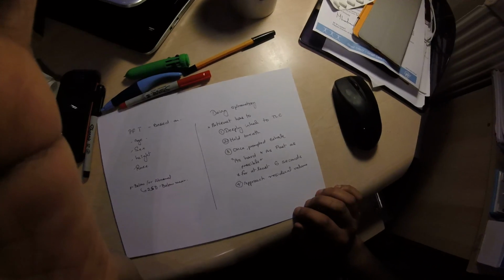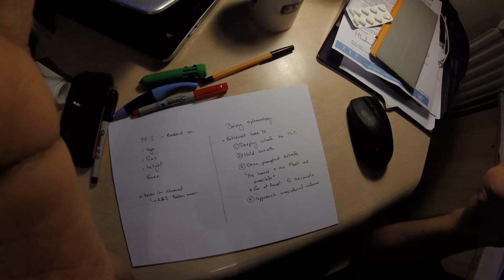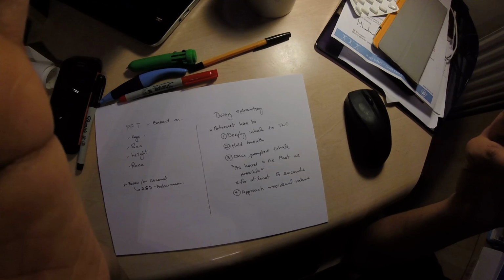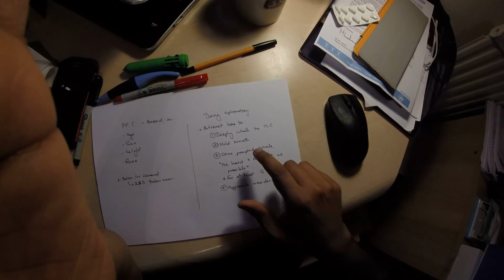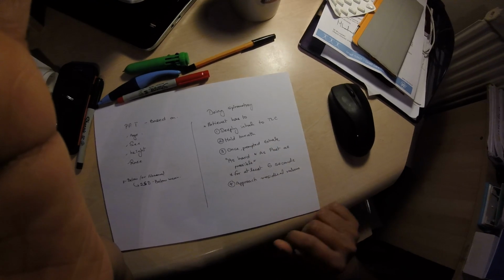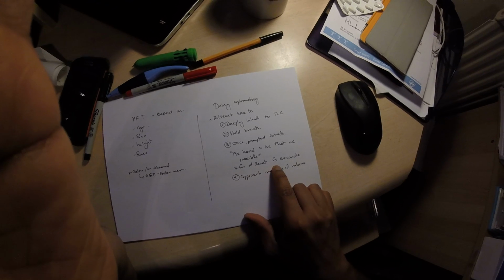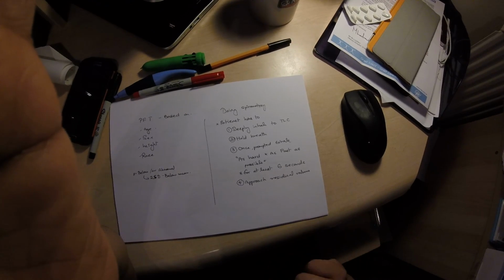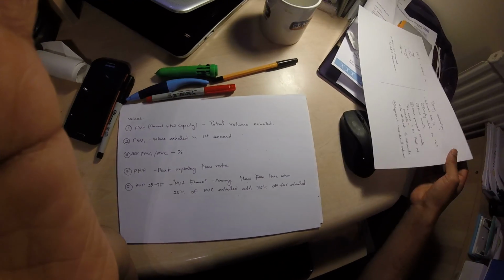What do we do when we're doing a spirometry? While doing a spirometry, the patient has to be able to comply with the test or understand the test, and they should be able to, one, deeply inhale to total lung capacity, hold their breath for a few seconds, and once prompted they should be able to exhale as hard and fast as they can for at least 6 seconds, and hopefully get to their residual lung volume. So that's the basic thing you need to know about spirometry.